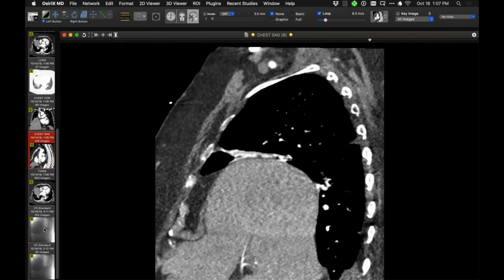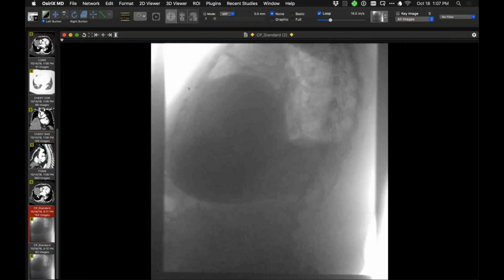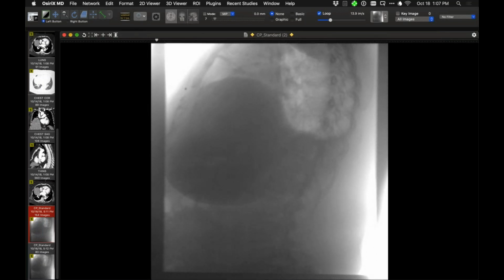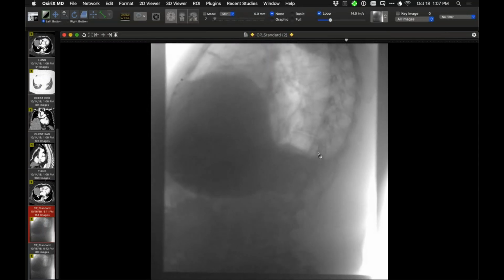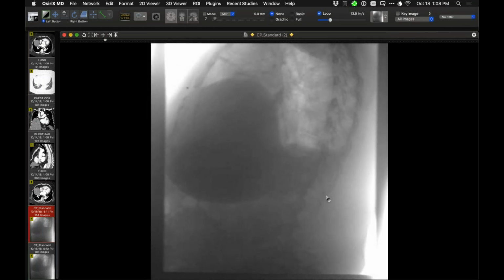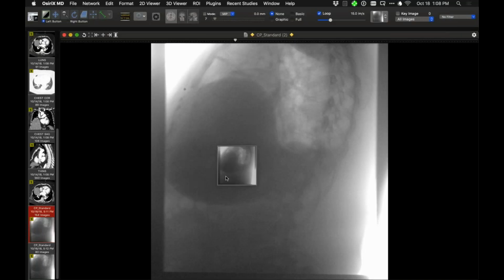I'm going to show two sequences from the fluoro. And here, as we've talked about before, it's really important to fluoro in the lateral projection so one can see the entirety of the diaphragm. So I'll start this, and first of all, even with a normal breath, one can see the posterior diaphragm on the right side moving. There's a deep breath. Here comes a deep breath, so it does go down. And the anterior portion over here kind of stays there.